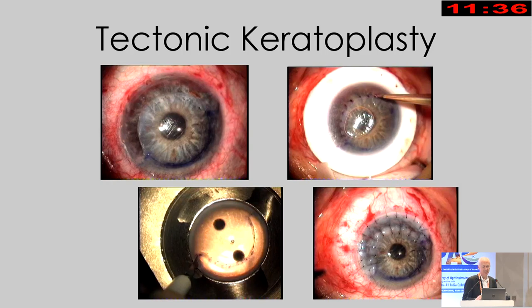So the conventional approach to a macro perforation surgically is to do a lamellar dissection. Is there a pointer here? Is there some kind of, or can I point with the mouse? It will work anyway. Oh, there we are.